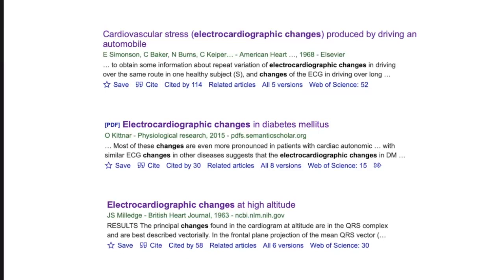And so the process of diagnostics generally, certainly from ECG, is a process of elimination, saying, well, it can't be that because the QRS has a normal width. So it can't be a bundle branch, or it can't be slow conduction because everything is running in a normal time. The ST segment is flat, so it probably isn't related to ischemia or Brugada or a few others. There's this long logic tree that gets set up in a lot of medicine to try and identify diseases from a set of symptoms.